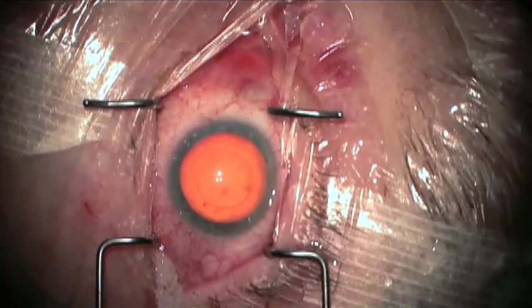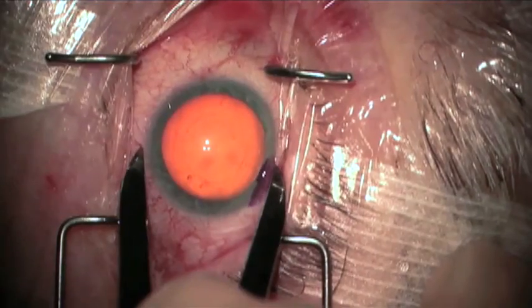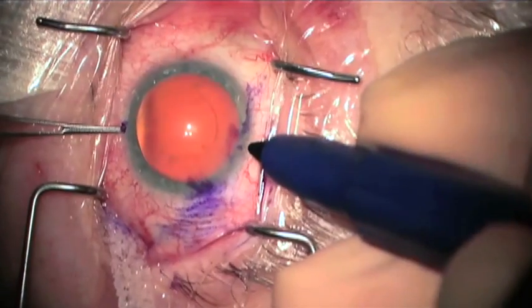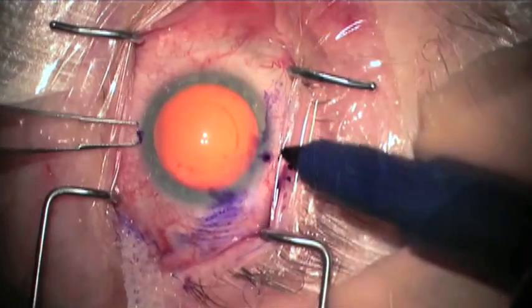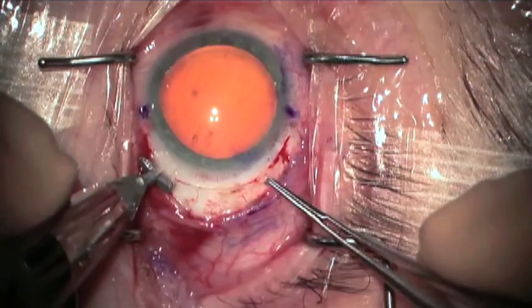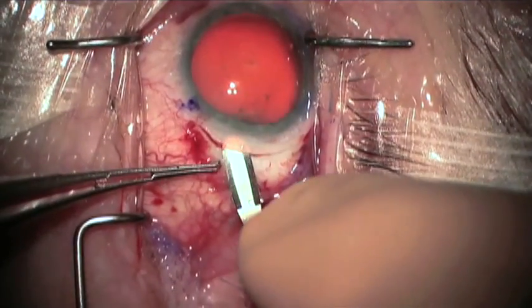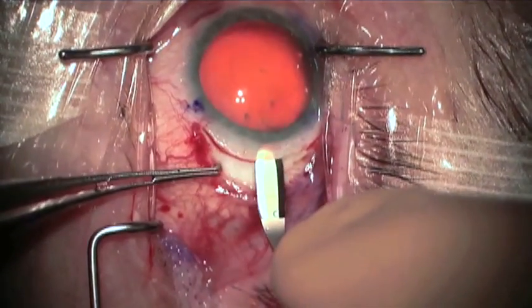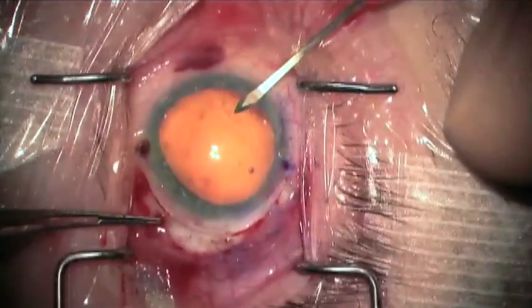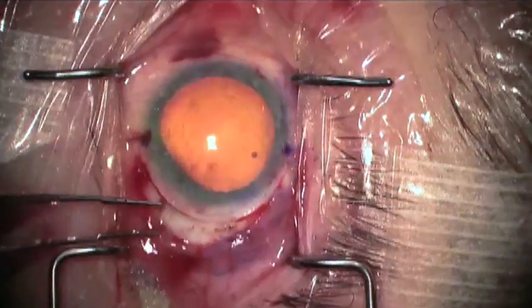Surgery begins by marking the cornea for a capsulorexis guide. 11.5 millimeters is marked on the conjunctiva, and following conjunctiva peritomy and episcleral cautery, a 300 micron groove is created for 11 to 11.5 millimeters, about 1 millimeter posterior to the limbus, and dissected anteriorly with a crescent knife into clear cornea.